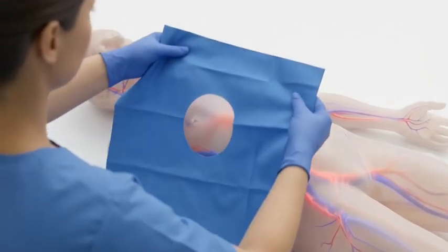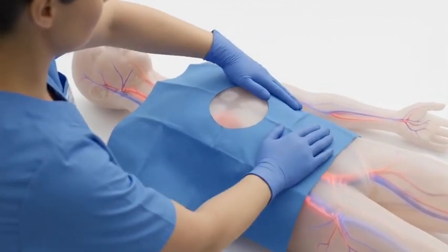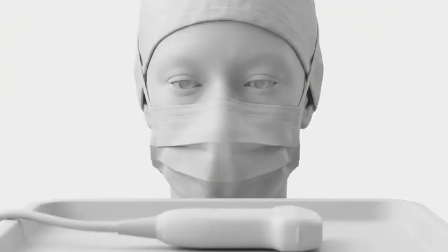With the location verified, the next steps are to establish a sterile field and proceed with the physical insertion, always following local clinical protocols under appropriate supervision. Clinical confidence during the physical procedure relies on absolute certainty in the anatomical map you have created.